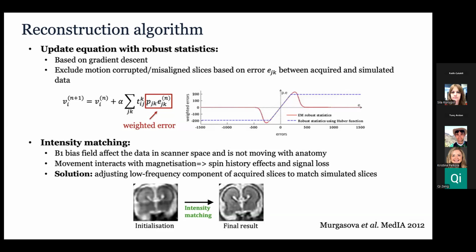But I think there is something called dream or something like that, that on the scan has a method to correct it, and maybe shimming. So it all depends on these things. And there might be variation with manufacturers, but I think Philips were a little better. Yeah, I think that's our experience as well. Working with other sites, Siemens is a little worse than Philips.